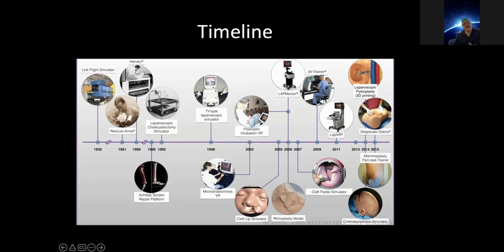So for a surgeon, that's actually very poor. There are other early simulators where people were trained for laparoscopic surgery with only a blind box, and to get some haptic feedback, you basically manipulated little rings. So the haptic feedback is, in all fairness, a major problem with these surgical simulators.